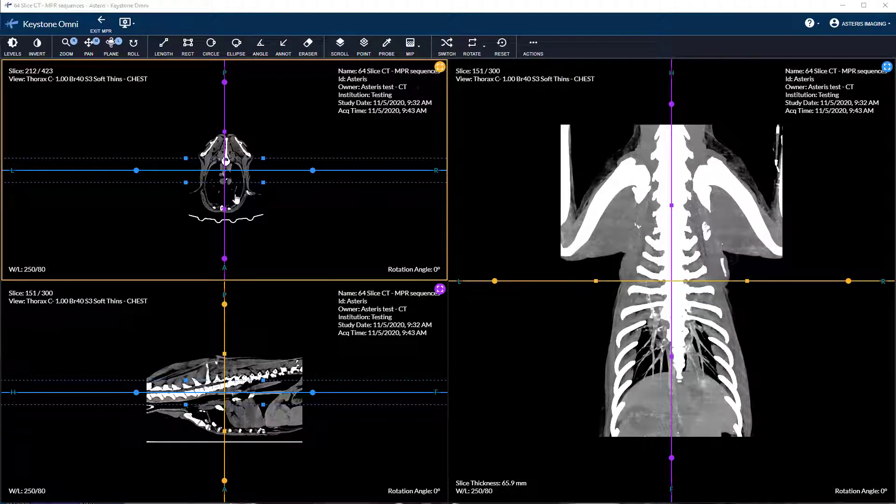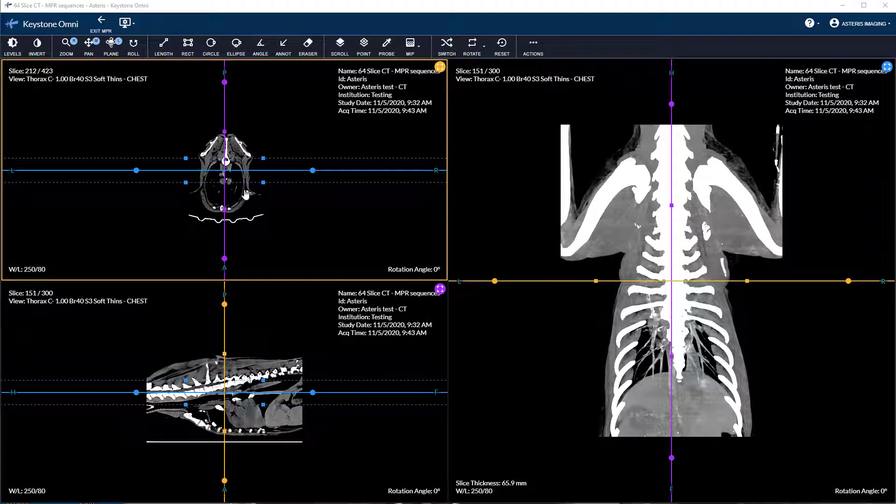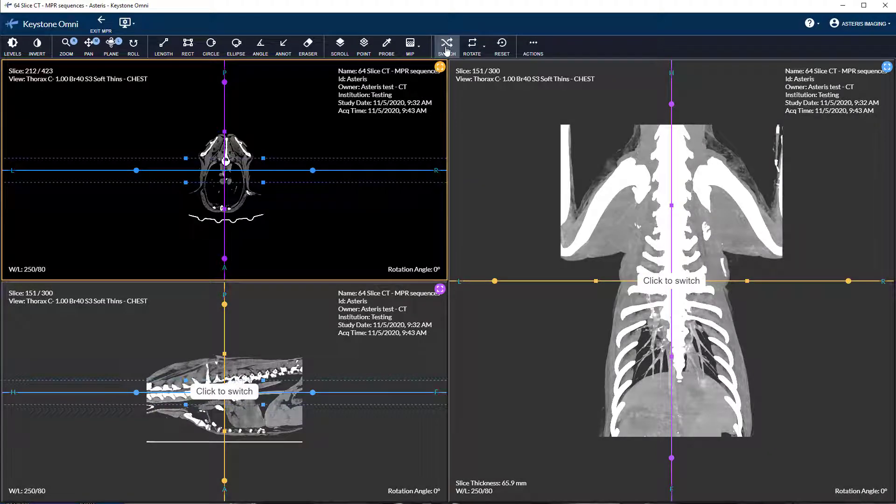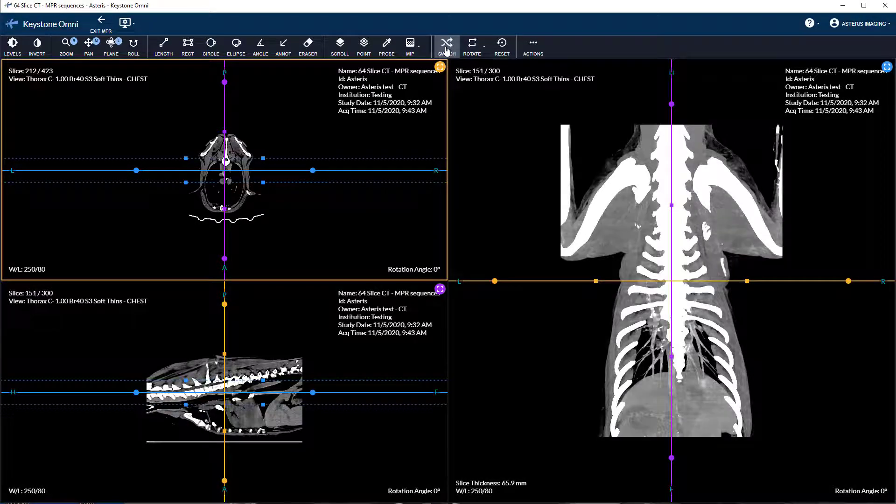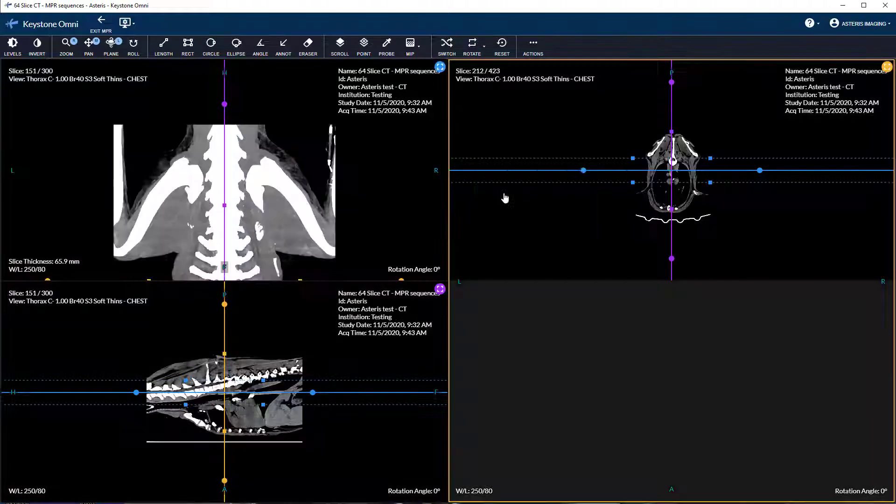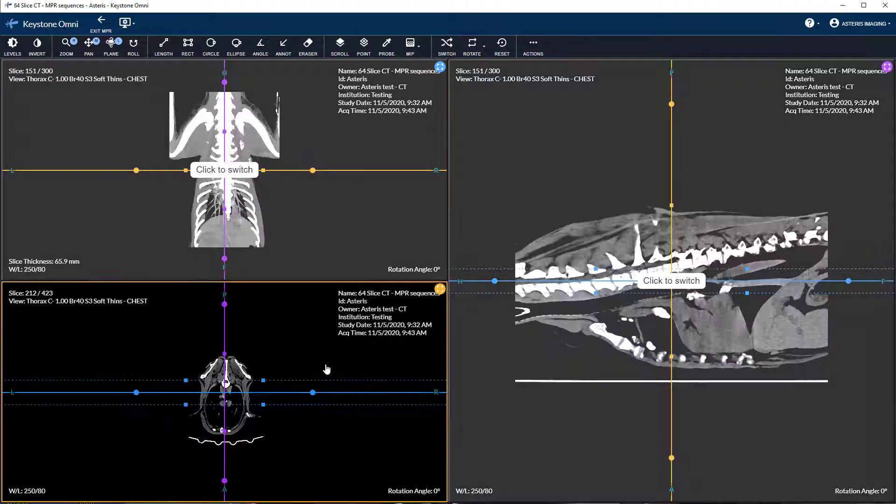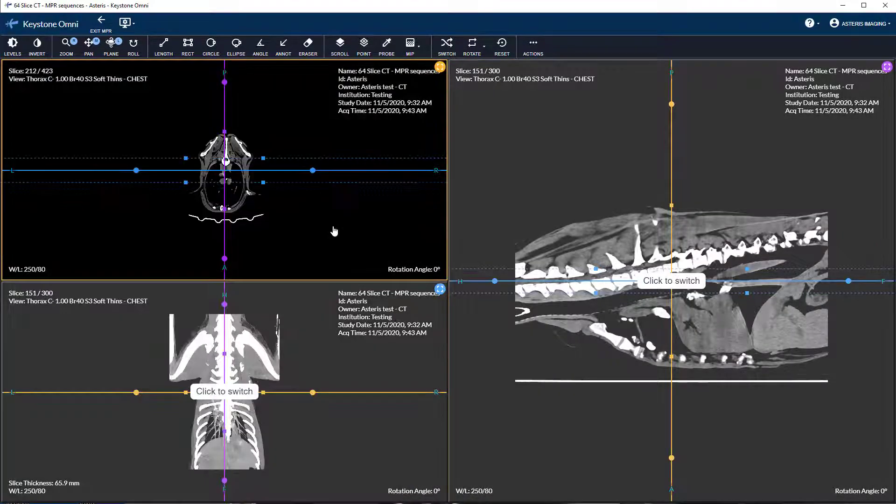The switch tool allows you to toggle the position of the active view with another view. You can utilize alt plus click or option plus click for Mac as a shortcut.